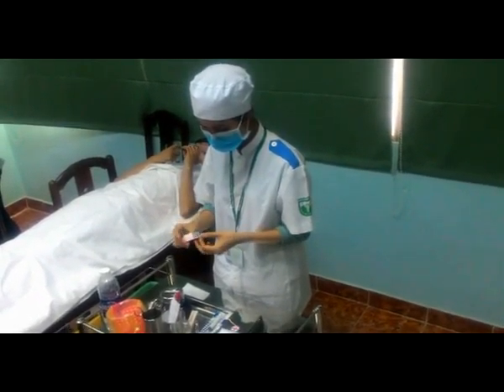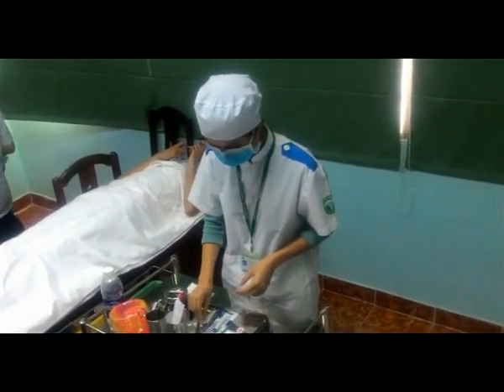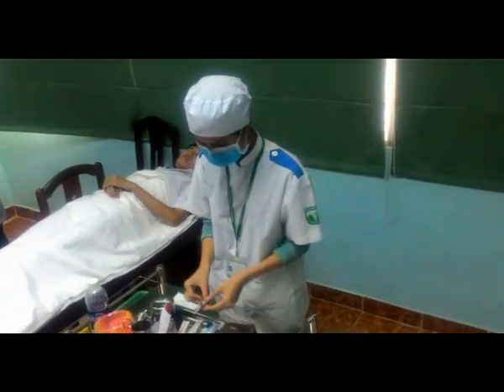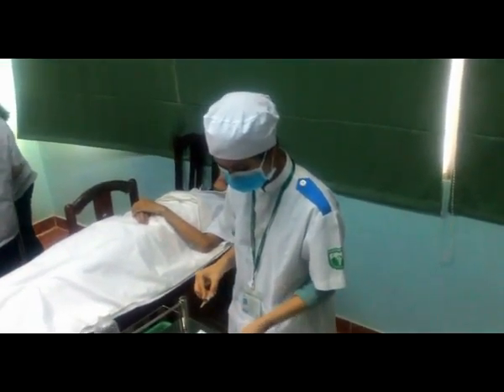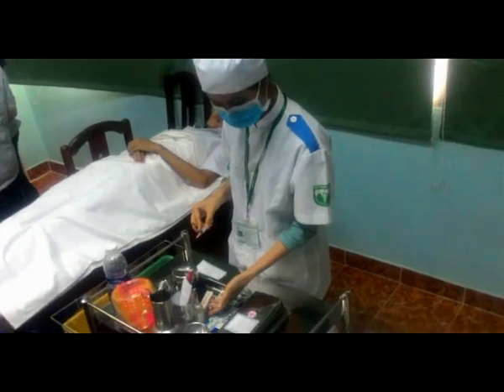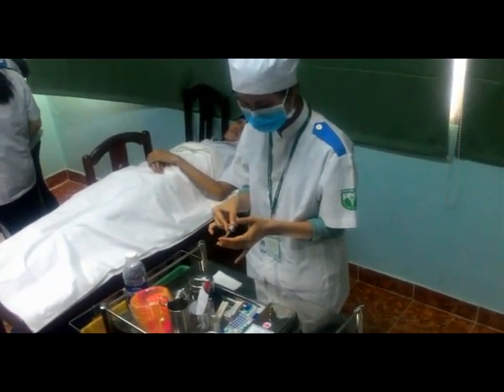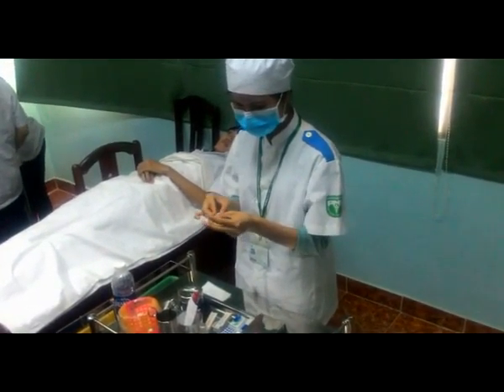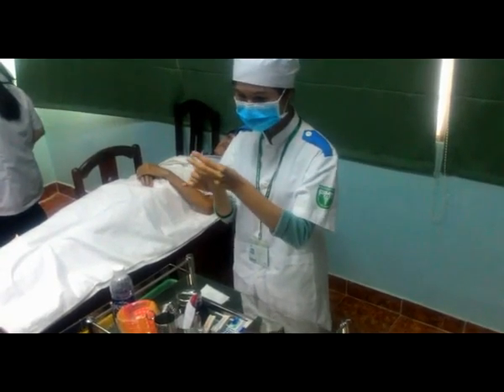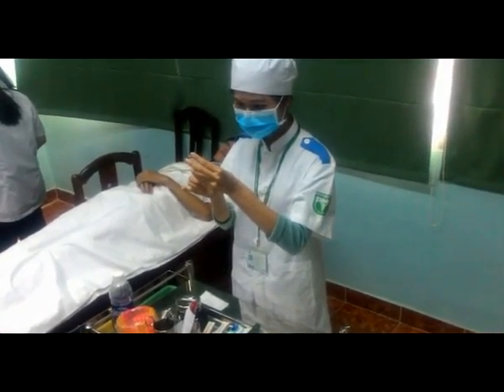Bảo quản kim tiêm. Rút nước cất: tay thuận cầm bơm tiêm, tay không thuận kẹp ống thuốc bằng 2 ngón. Lưu ý không cho tay chạm vào kim. Rút hết nước cất.